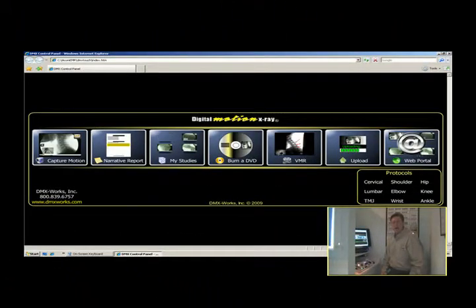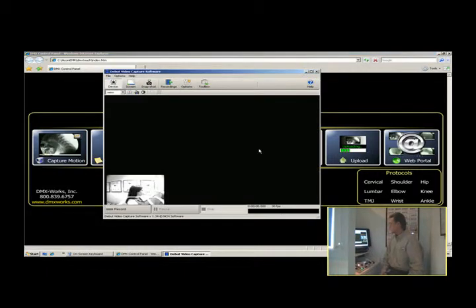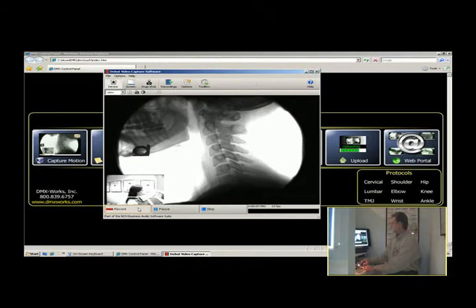Hello again. I'm now behind the control console, and we're going to go ahead and perform the flexion extension digital motion x-ray study on Rachel. It's as simple as touching one button, capture the motion, and now we're ready to do the digital motion x-ray procedure. It's as simple as pushing one record button on the screen, pushing the x-ray on button, and adjusting the KVP so it looks perfect.